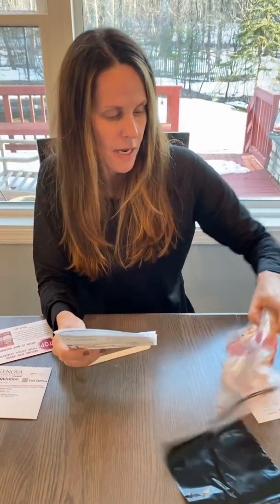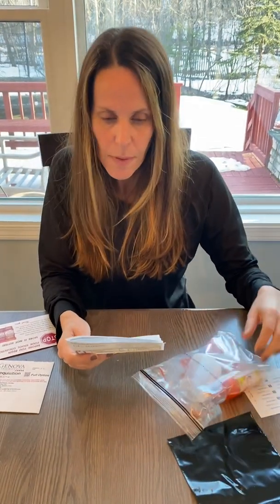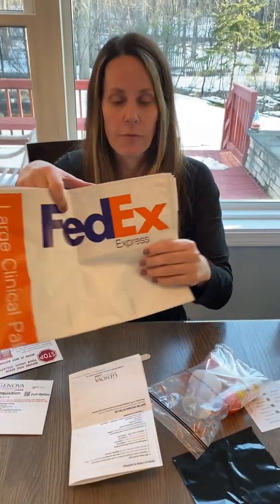Then you fill out your insurance information, the payment method, make sure everything is tightened. You put your date of birth on each one of the samples, it shows you, and your name, and then you refrigerate them. And when you're ready, you then call FedEx, and they will come and pick this up from your home and get shipped off.